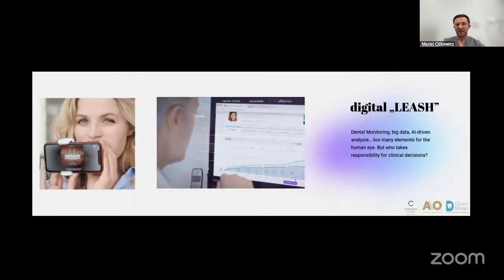So if you don't want to waste your time, it's better to do it without something like the leash. Think about it: if you educate the patients on how the aligners should fit very well, you don't have to educate them on how to scan and check the system.